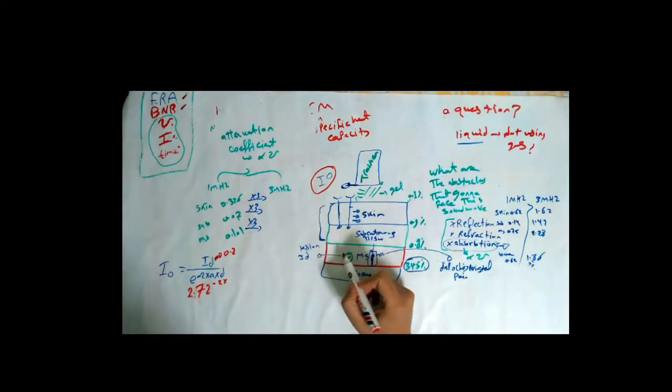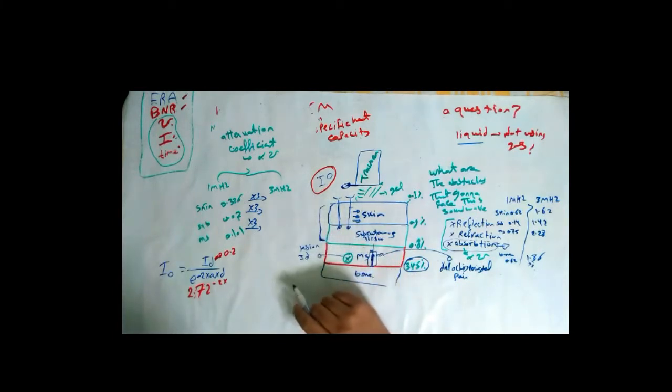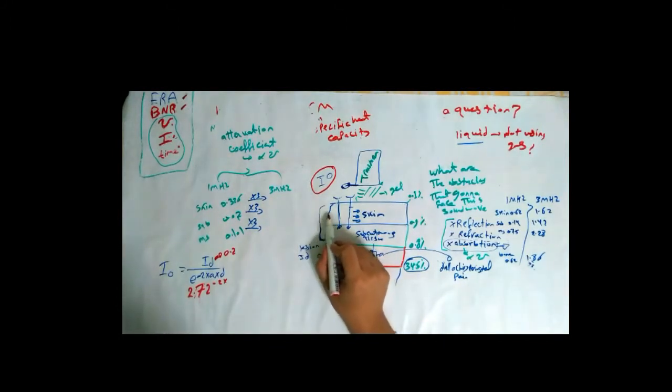In this case, I'm treating the muscle, so the medium above the muscle is the subcutaneous tissue and the skin. First I have to measure the thickness of the subcutaneous tissue and the skin. I can measure the subcutaneous tissue by using a skin caliper. The skin varies in the body, with 0.5 millimeter in general.